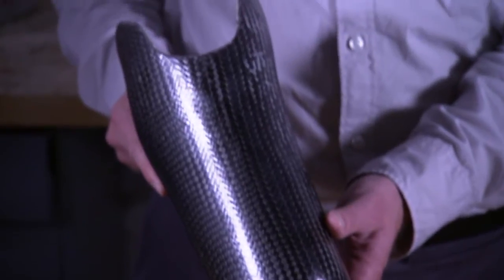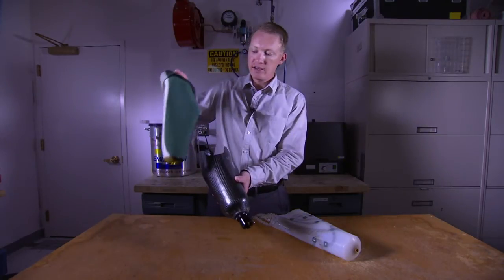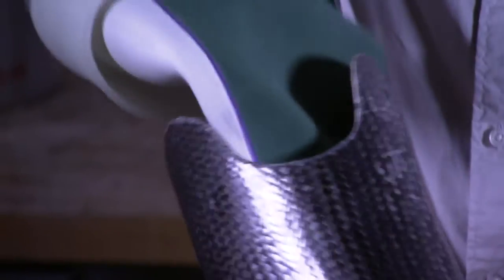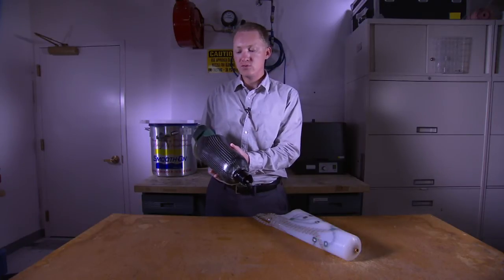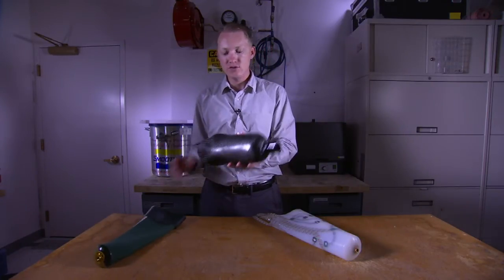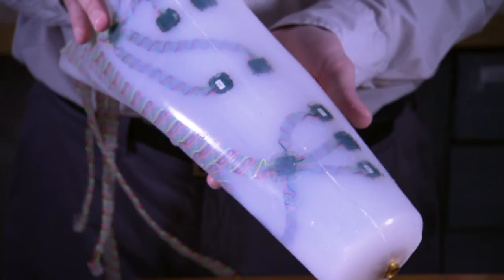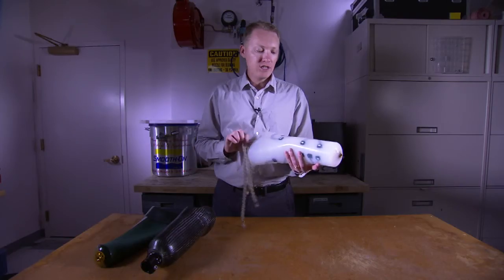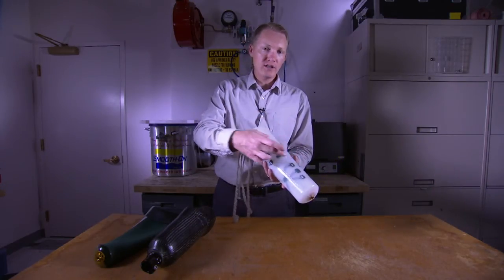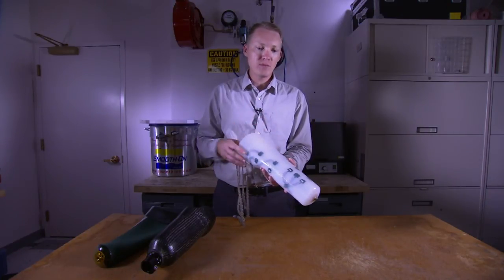This is an example of a conventional prosthetic socket — it's custom fit to the anatomy of the amputee's residual limb. Typically, an amputee would wear a gel liner like this one inside of the socket to provide some cushioning. To improve upon this conventional technology, we've integrated our technologies directly into the liner. We've integrated sensors at several different locations inside the liner, which allows us to monitor the fit and see if it's deviated from what the prosthetist intended.